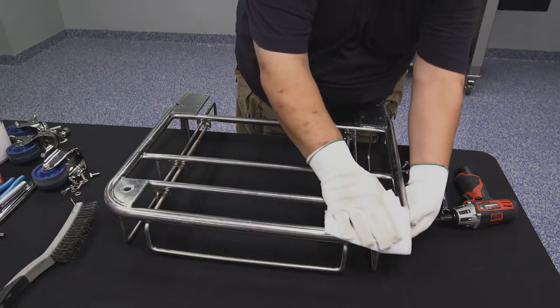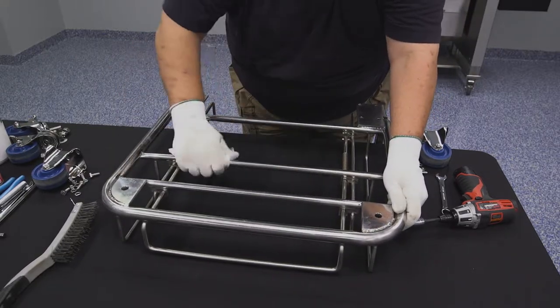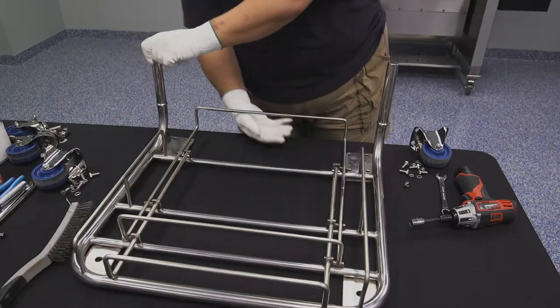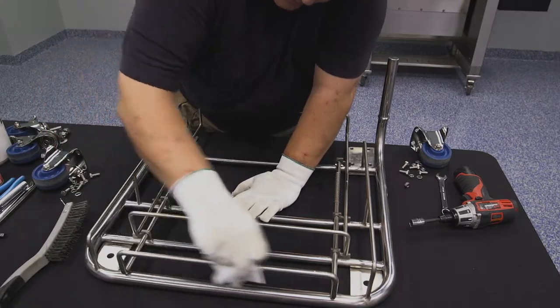Clean the trolley base with an IPA pre-saturated wipe and remove all chemical residue and contamination. Pay close attention to the bottoms of rails, the area where casters are mounted, and any flat surfaces where chemical residues or other contamination might build up.